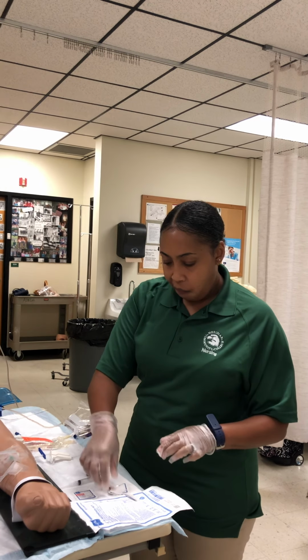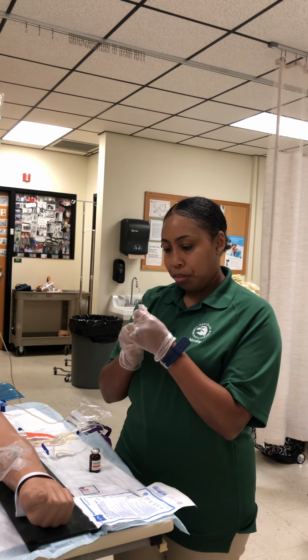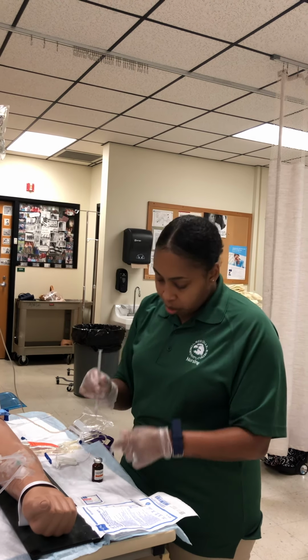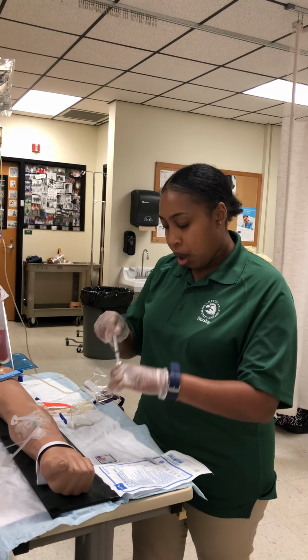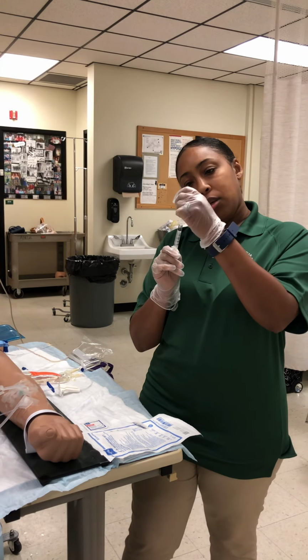Okay, discard. And now we're going to draw up our 3 milliliters.